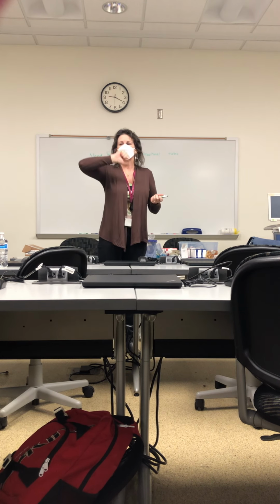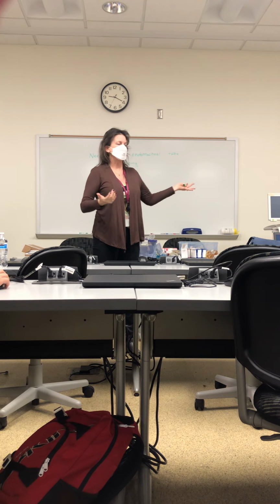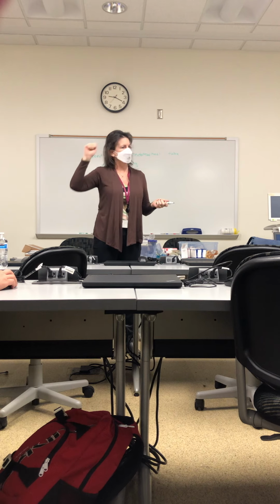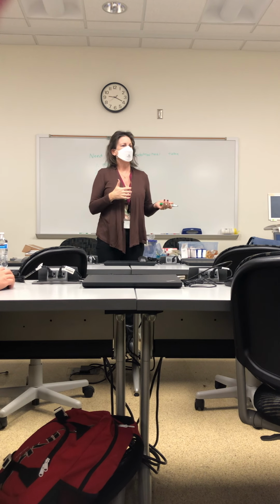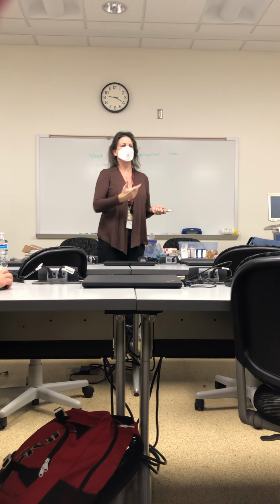So we've done it. We're getting a lot of secretions up. They're thick, and the patient's sats are coming up because we're getting all those secretions out. But now, 30 minutes later, you have to do it again, and you caused some bleeding in that naris. What can we do to prevent more bleeding when we have to suction again? We're going to lubricate.